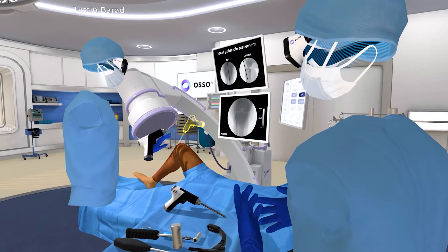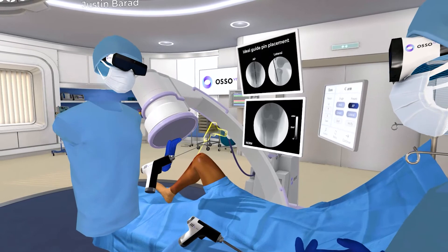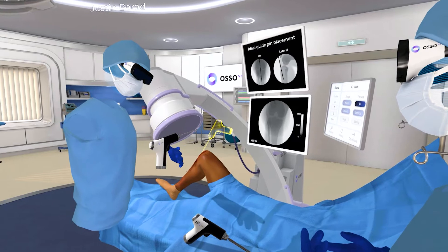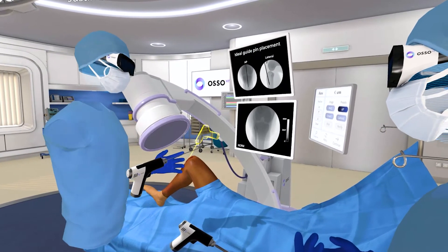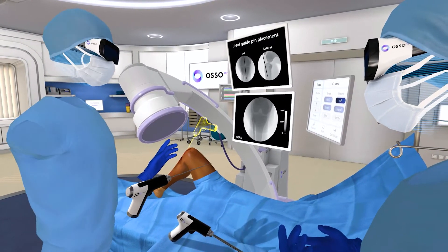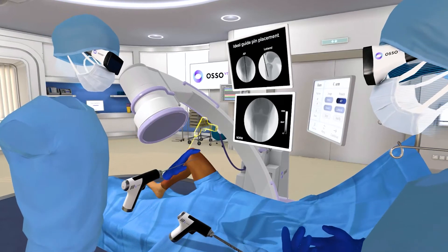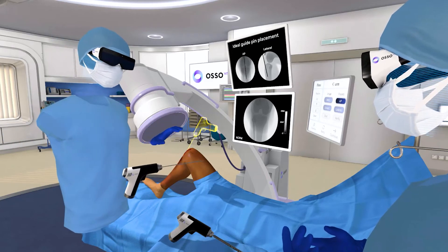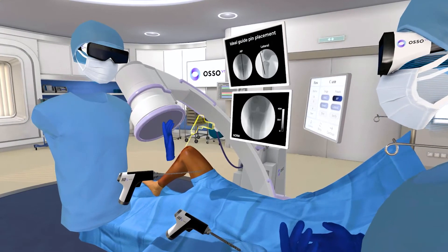There's a tibial shaft fracture here. One of the first steps of this case is to determine where our implant is going to go in the bone. Outside of reducing the fracture — meaning lining up or setting the bone — this is probably the most important part of the case. If the nail is improperly positioned, you're going to get deformity at the fracture site, some kind of issue in the joint, or postoperative pain. This is a very small wire, so you can reposition it multiple times to make sure the position is perfect, and then you drill a hole around this wire to determine where the implant goes.